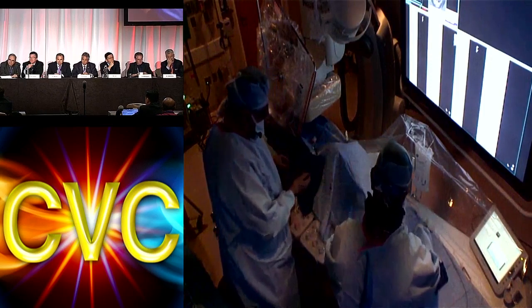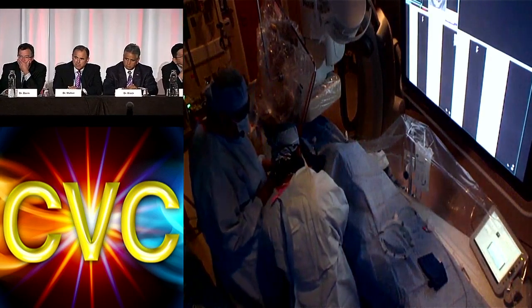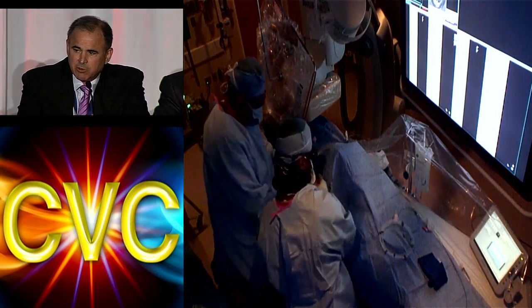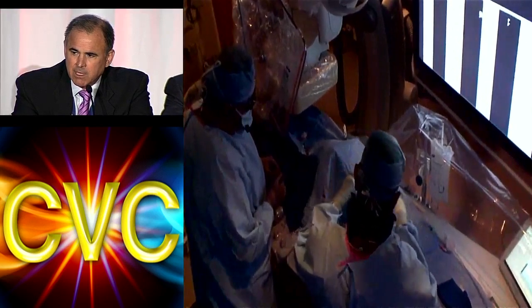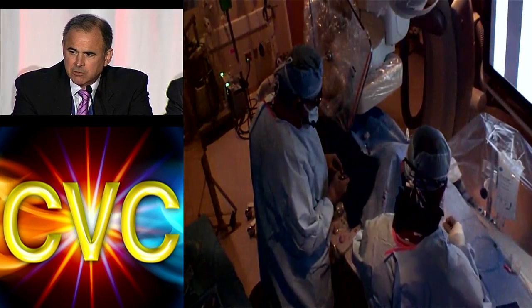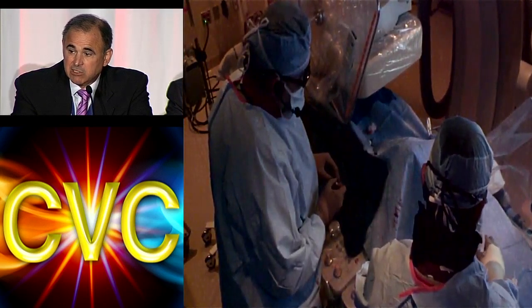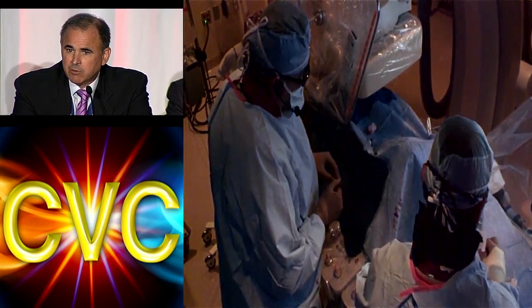If I were going to use a wire here, one of the wires I really like with roadmap is this Victory series of wires that's recently come out. I think they're very torqueable. You can get nice pressure on the lesion, and they've got nice tactile feedback. For me, crossing a CTO is as much about looking at the wire and making sure it is still moving and never bound down, as well as how it feels upon withdrawal.